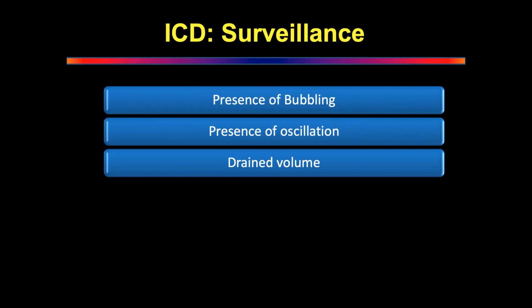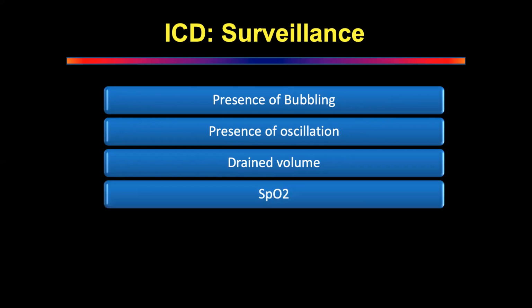Fixation of tube. Pain. What do you want to see? It should not be infected. Fixation. Fix properly. You look at the chest tube, you've seen the bubbling, you've seen the volume. What next? Fixation of the tubes that you have to check. Make sure the patient is okay, man. Okay, saturation. Also we have to see. Yeah? Okay, thank you. So make sure the patient is okay, for God's sake.